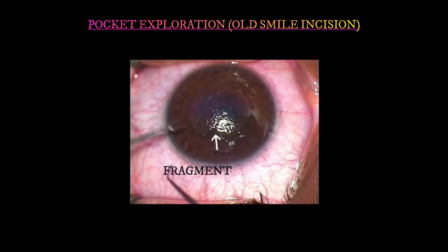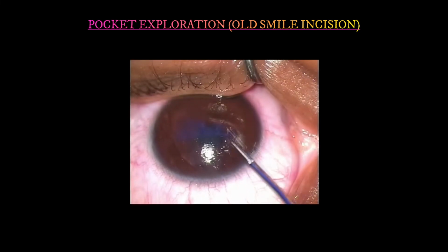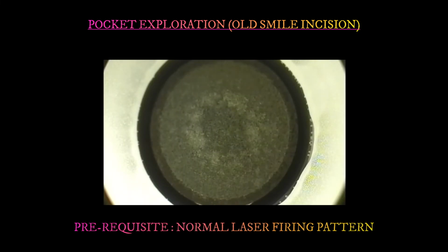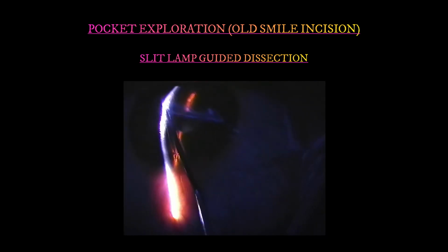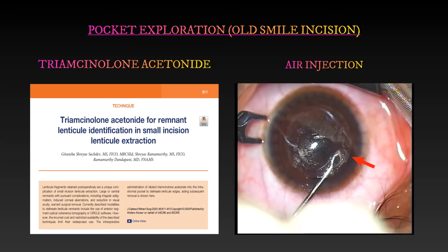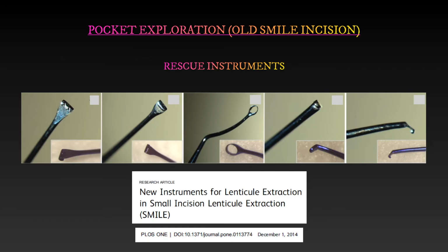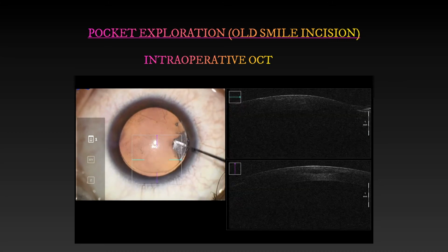This option may also be utilized to extract lenticular fragments causing significant topographic irregularity as long as the laser firing pattern is normal and devoid of large areas of black spots. Pocket exploration may be accomplished by slit lamp guided dissection, use of intraoperative triamcinolone acetonide or injection of air for enhanced visualization, use of certain rescue instruments, and application of an intraoperative OCT for accurate identification of lenticule planes.